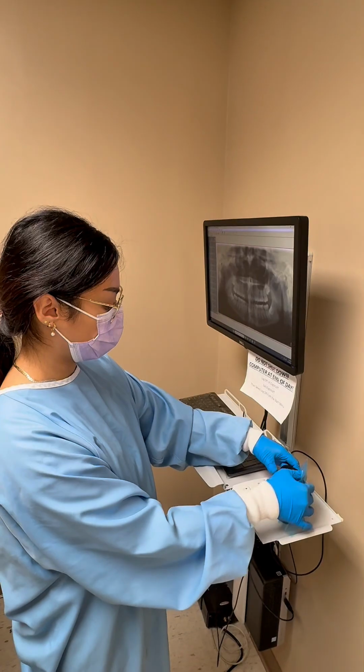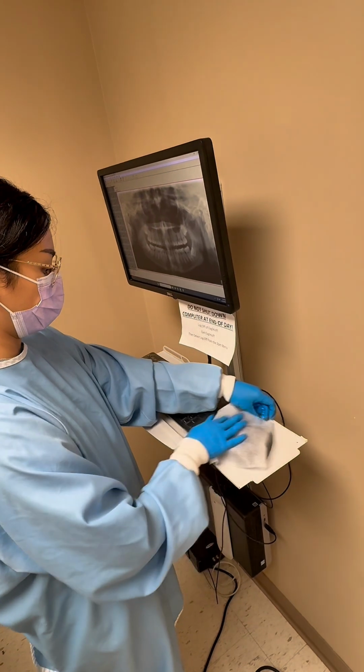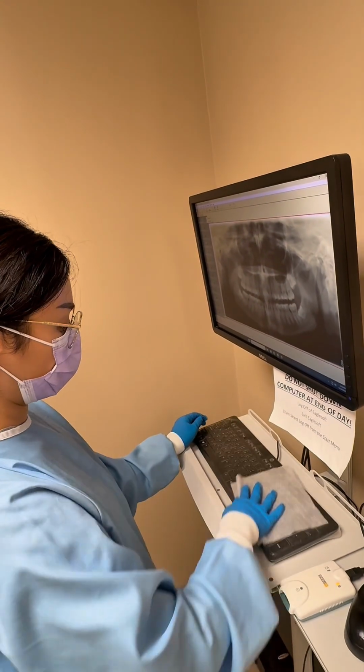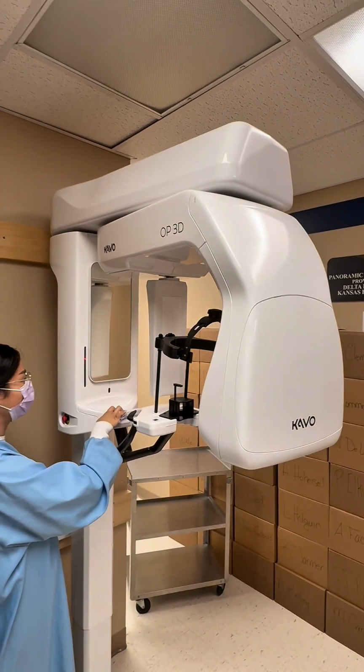Make sure to remove all barriers and disinfect all surfaces worked with in the radiography room G. Radiology support can help you with this if you are running low on time during the appointment. Make sure to sign out of EagleSoft and the computer before leaving. Lastly, raise the machine back up to its original position to be ready for the next clinical use.